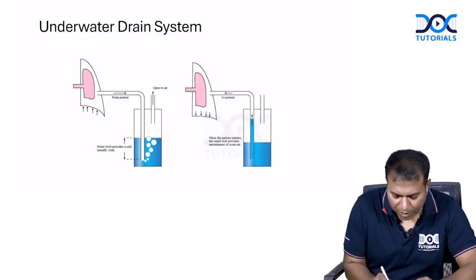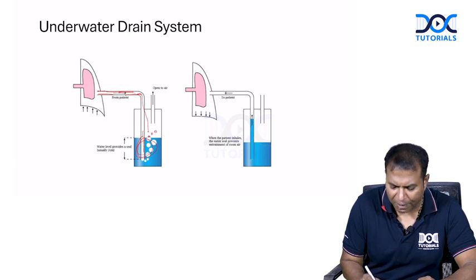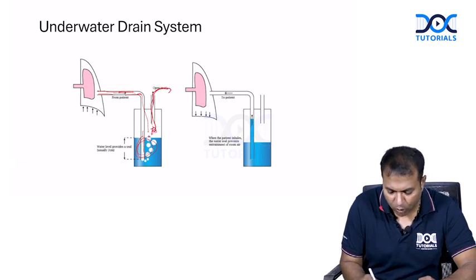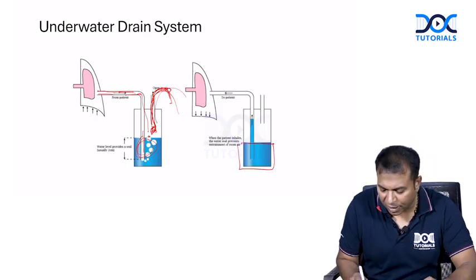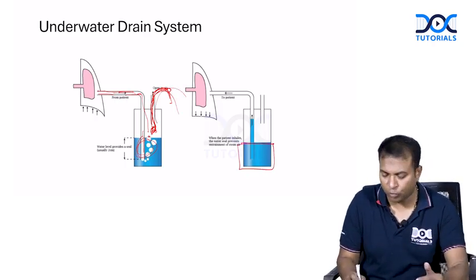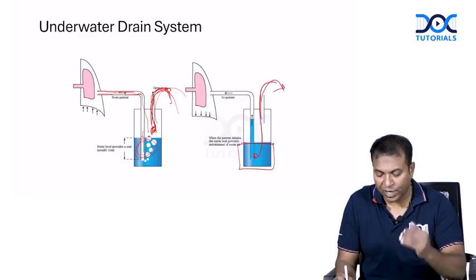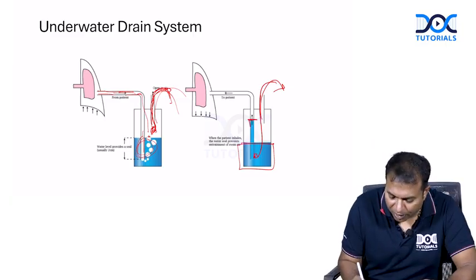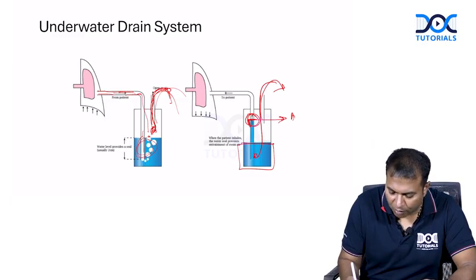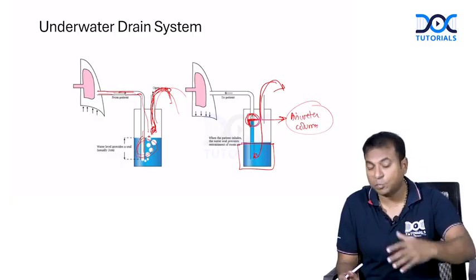You can see the pleural space; we have put a tube which is kept in the underwater drain. Whatever is coming out, for example air will go out like this, blood will go out like this, whatever comes out will be taken out this way. So this is an underwater drainage tube. It is an underwater sealed tube, so that air from here will not go back, it will only go like this. Once you put a tube like this, I can see this air water column in the tube. Very important. Please understand, this is the air water column. I will be asking a question on this later. Just remember, this is an air water level which is seen in the tube moving with the respiration.